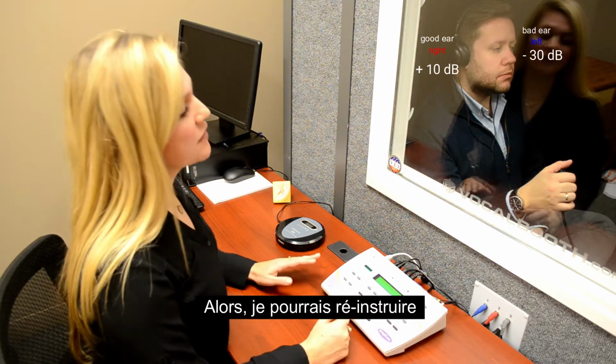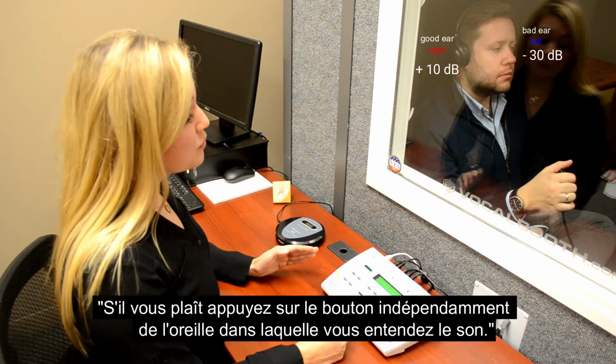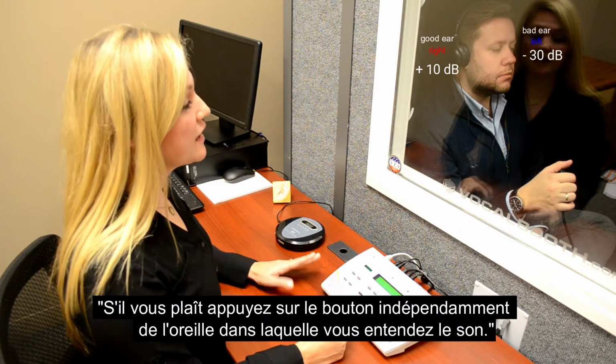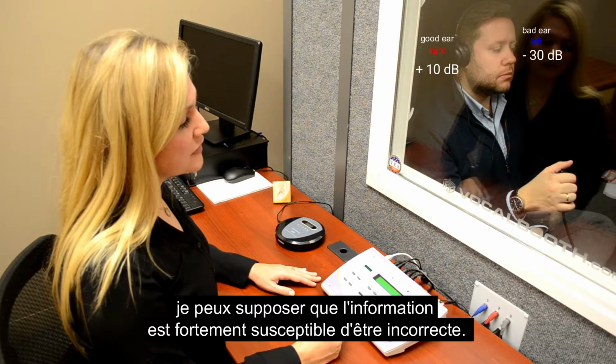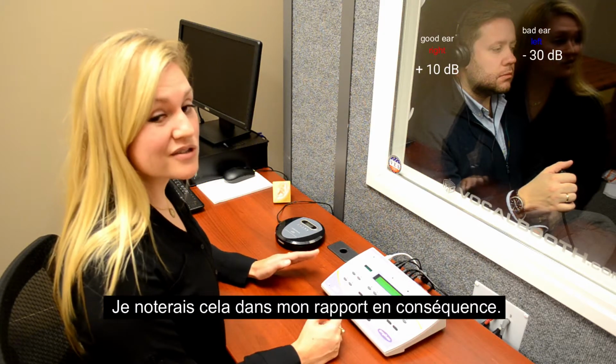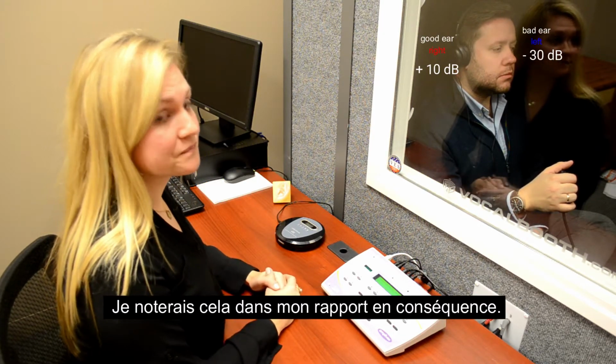So at this time I could re-instruct him and say, press the button no matter where you hear it. But if he still doesn't participate, then I know that what I'm getting in the left ear is probably inaccurate. So I'll just write that in my report.